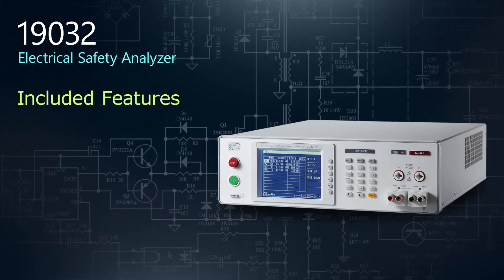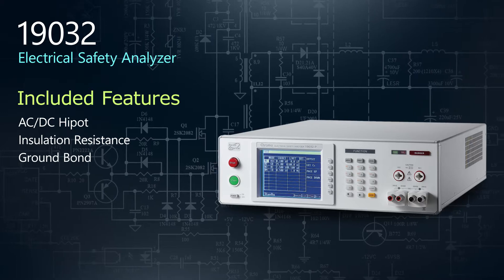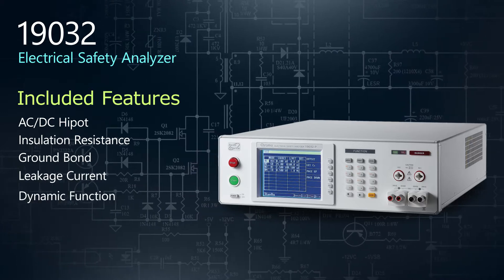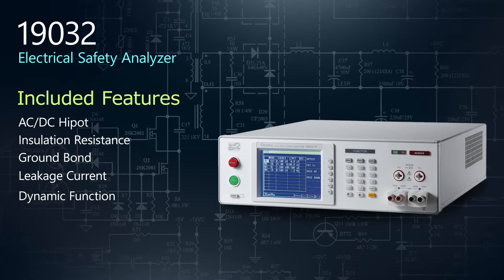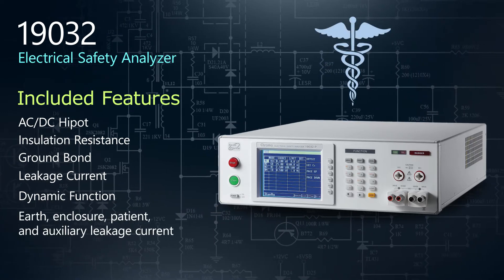Its multifunction design includes AC-DC Hypot, insulation resistance, ground bond, leakage current, and dynamic function tests in a compact unit. For medical device testing, scanners are also available for advanced leakage current tests.